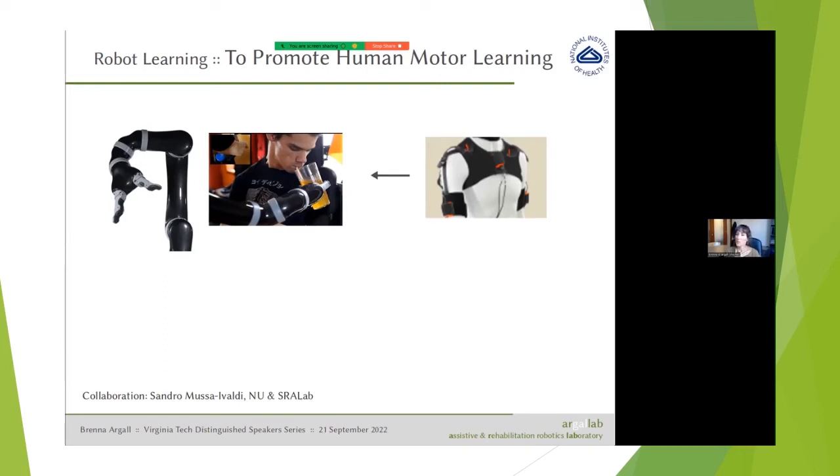It's a suite of IMUs, a net of IMUs that are placed over the upper body. They've shown that they can map this high dimensional control signal down to a 2D control point and use it to do a variety of things. They can type on a keyboard, they can play Pong, they can do all sorts of 2D virtual tasks and also drive a wheelchair, which is a 2D task.